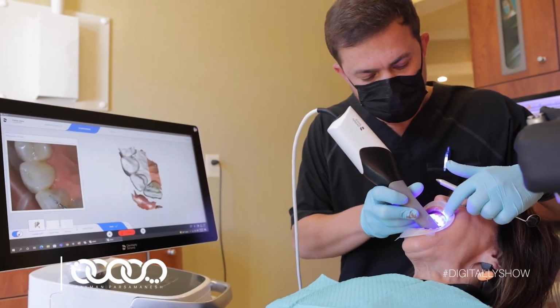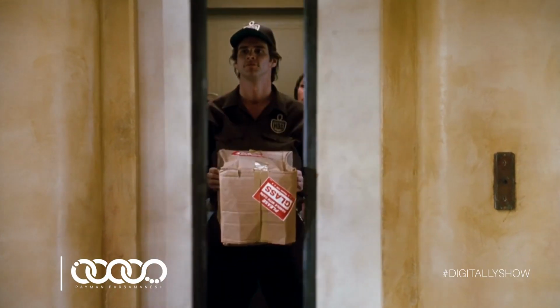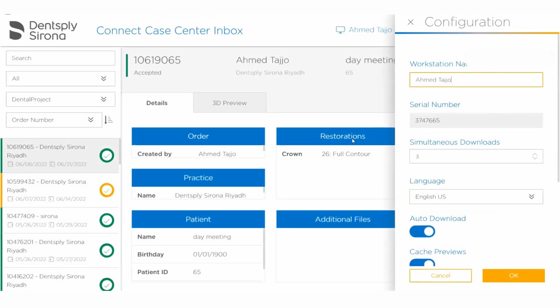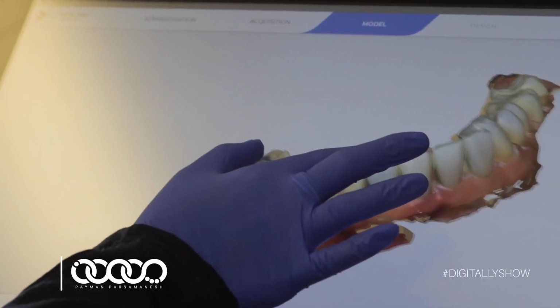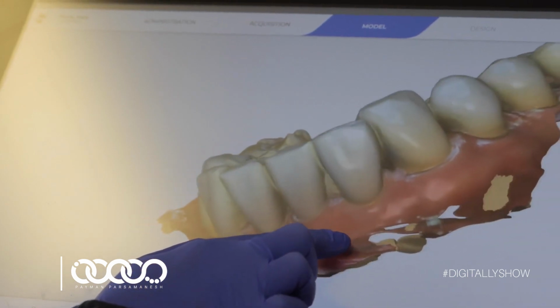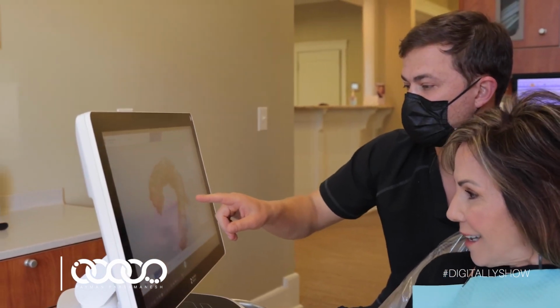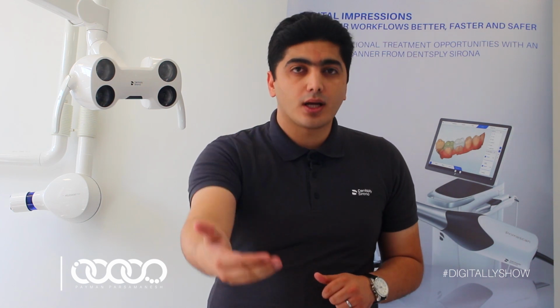Digital impressions significantly increase efficiency, accuracy, and productivity of your workflow. Conventional impressions must be delivered to a laboratory physically, which can cause damage risk and extra costs. But with DI, it is possible for dentists to email the virtual impression to the laboratory safe and sound. Also, digital impressions can be used to make same-day dentistry restorations, thereby speeding up patient treatment and reducing the need for multiple office visits. These are the key benefits of digital impression. So what are the other benefits?